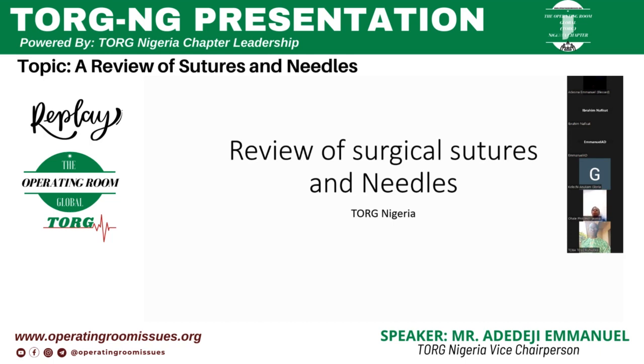People were using catgut to suture wounds. I remember when we started the training many years ago, synthetic sutures were not very popular then. We had catgut, which is a naturally occurring absorbable suture. So that will lead me to the next presentation.